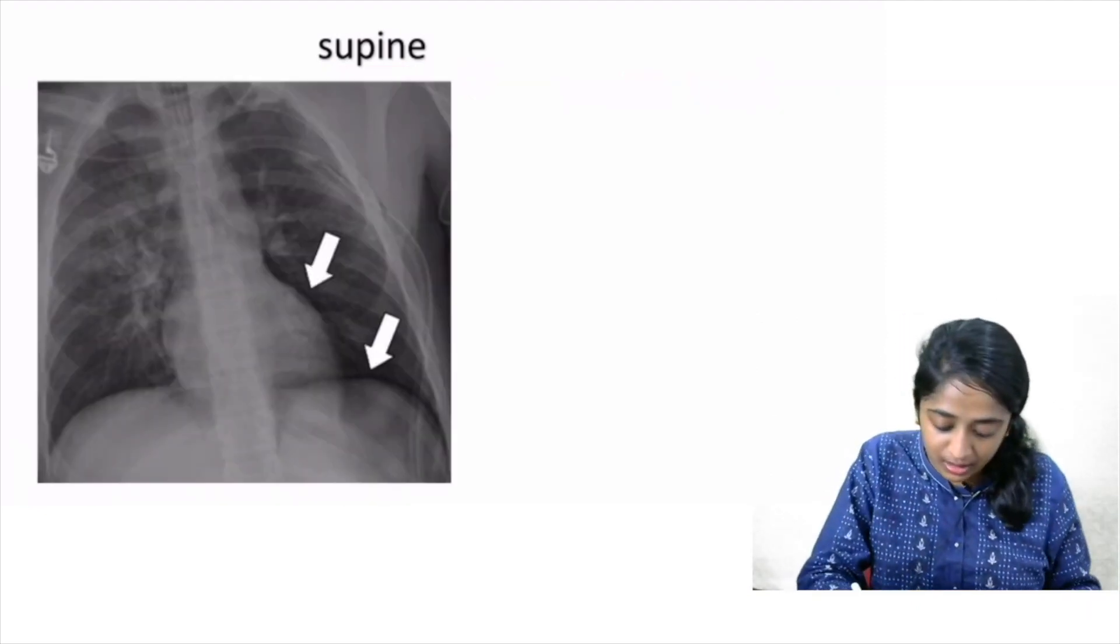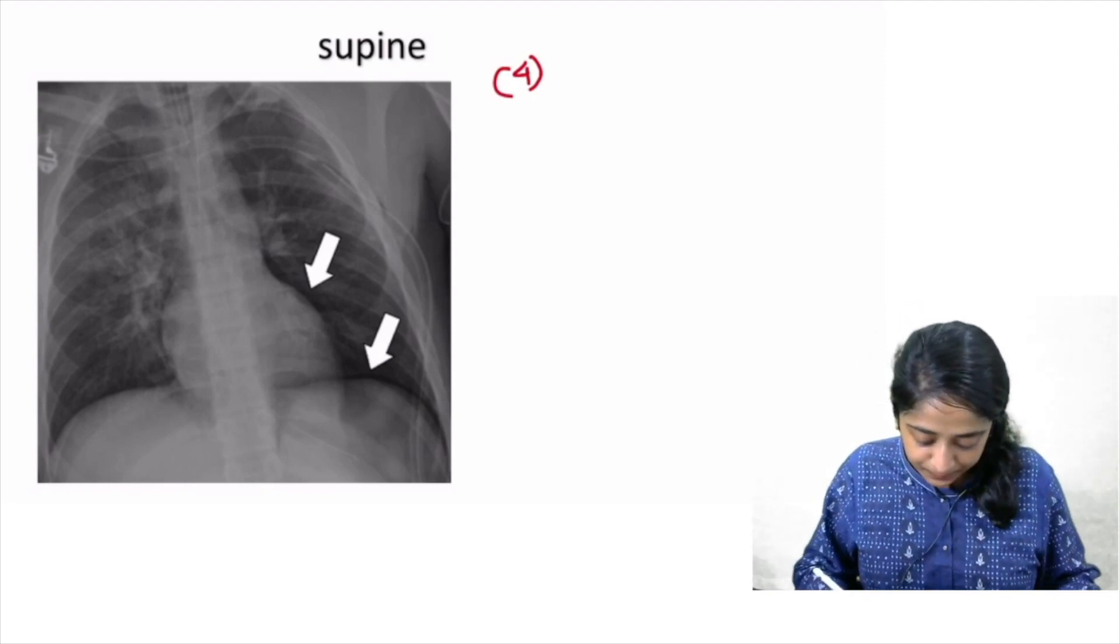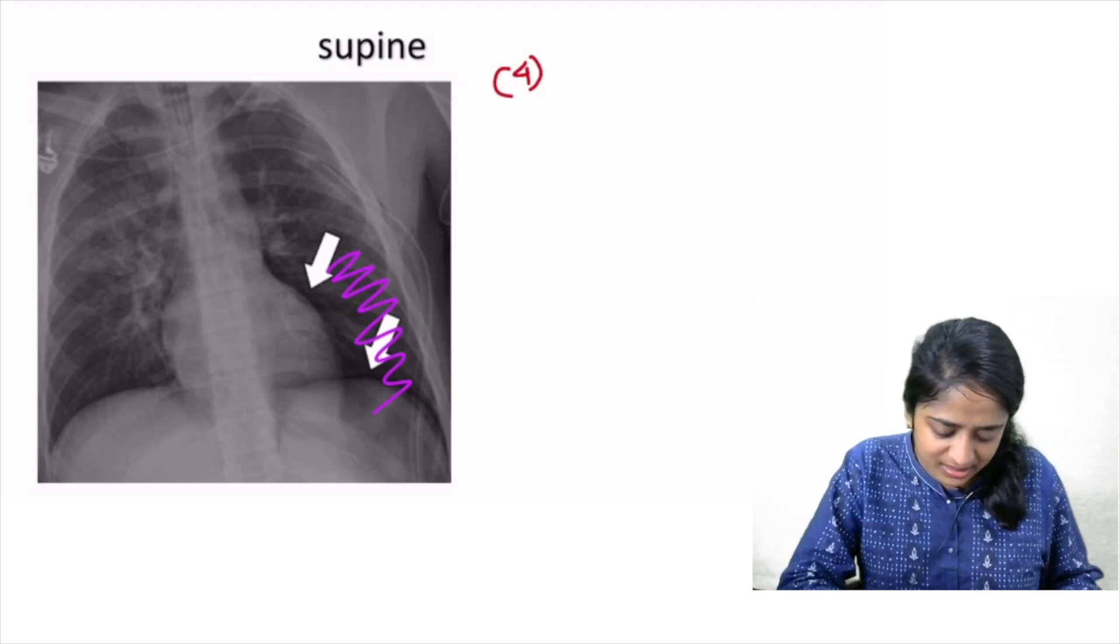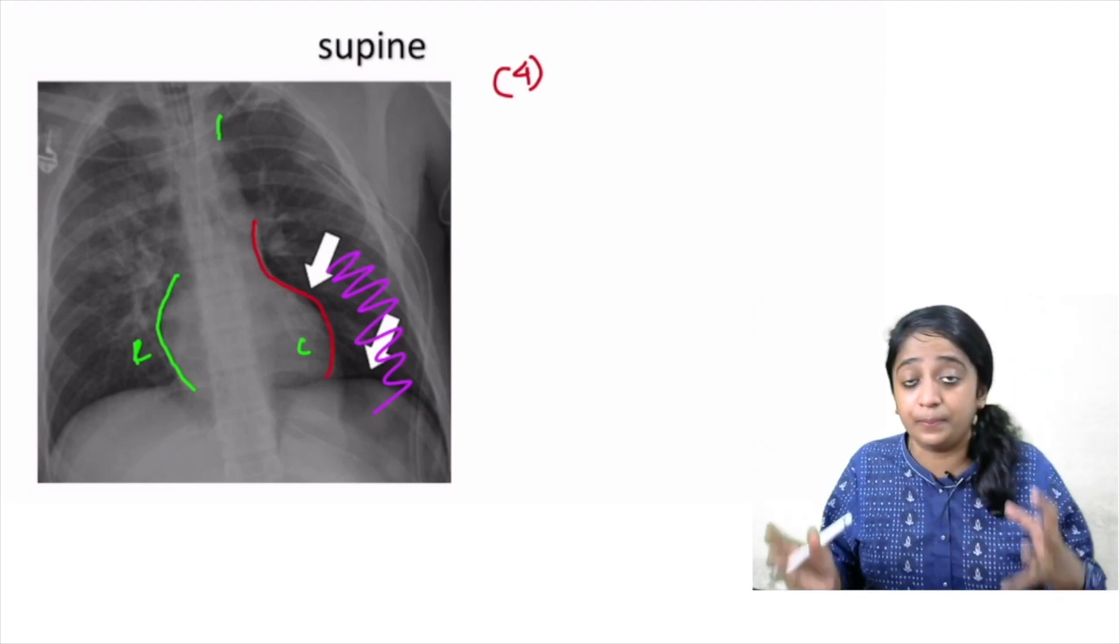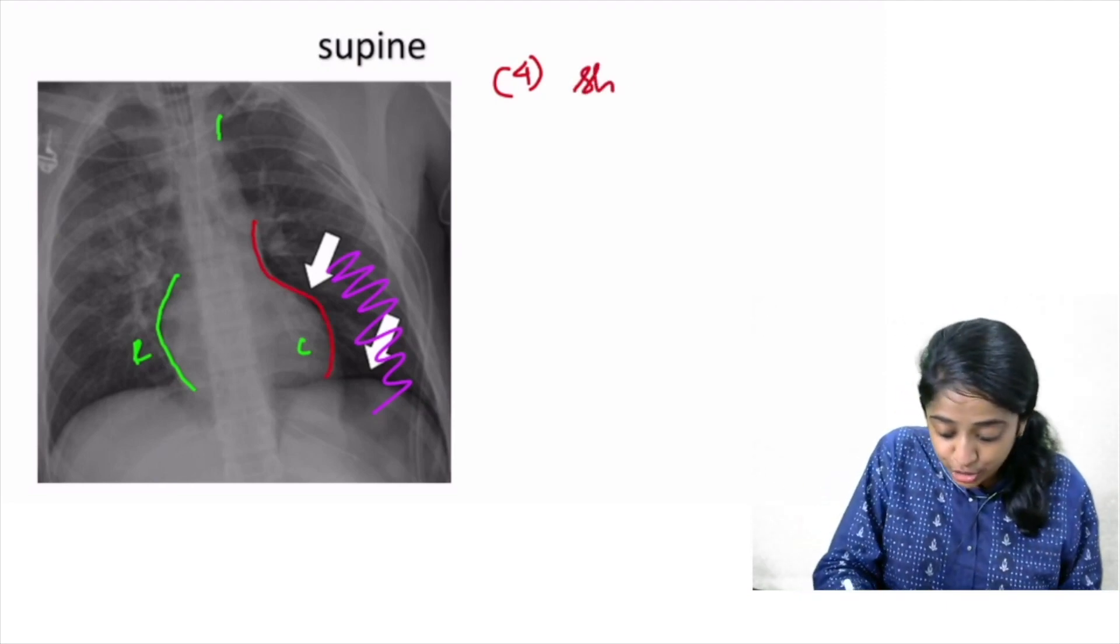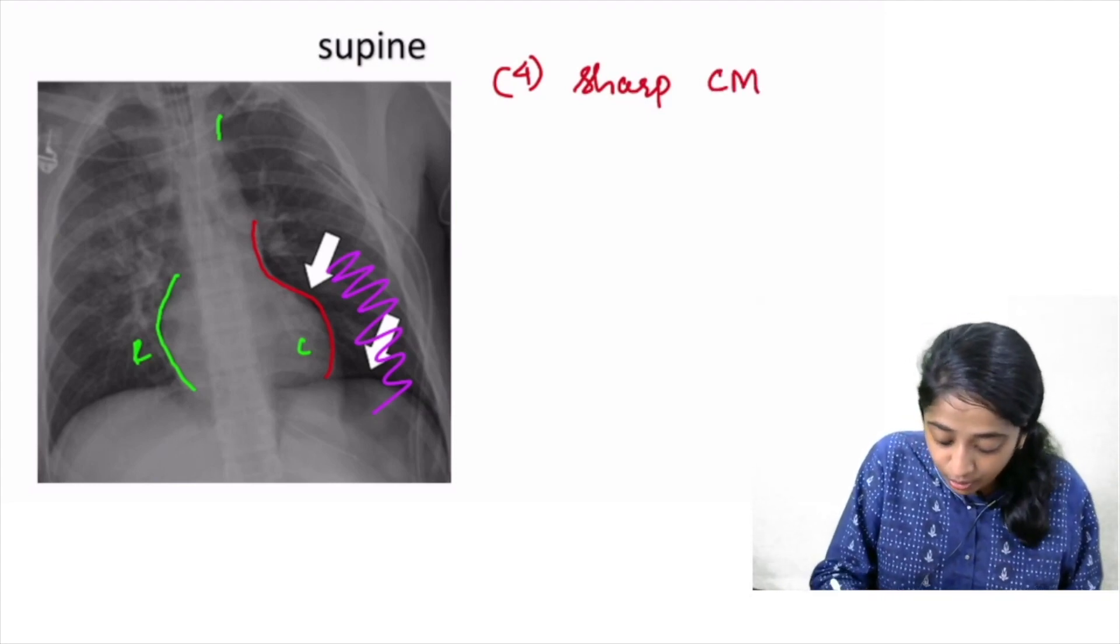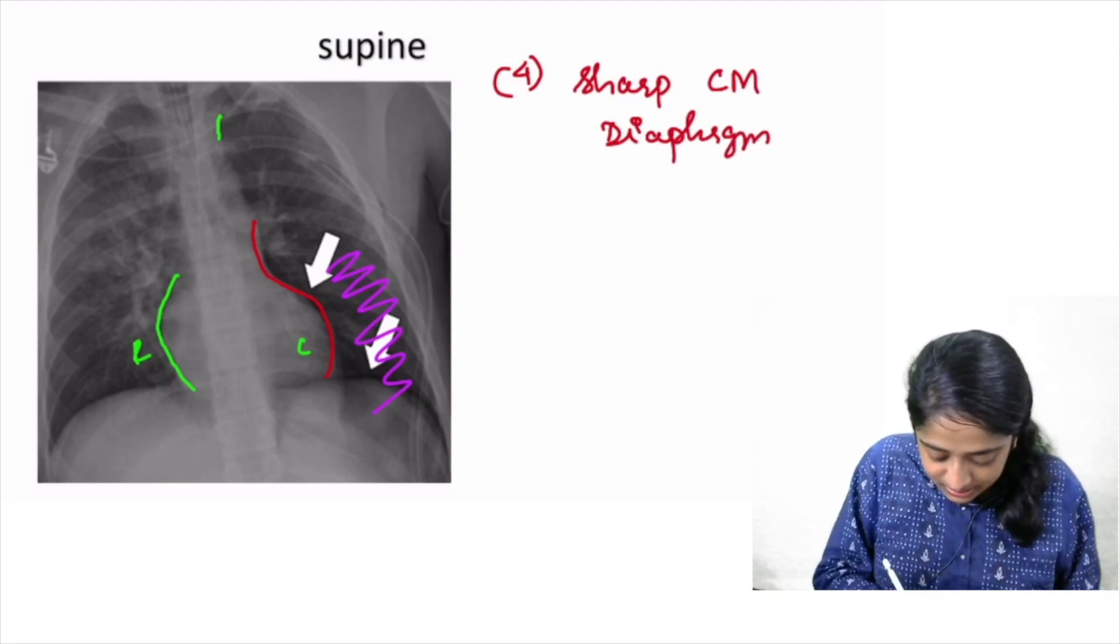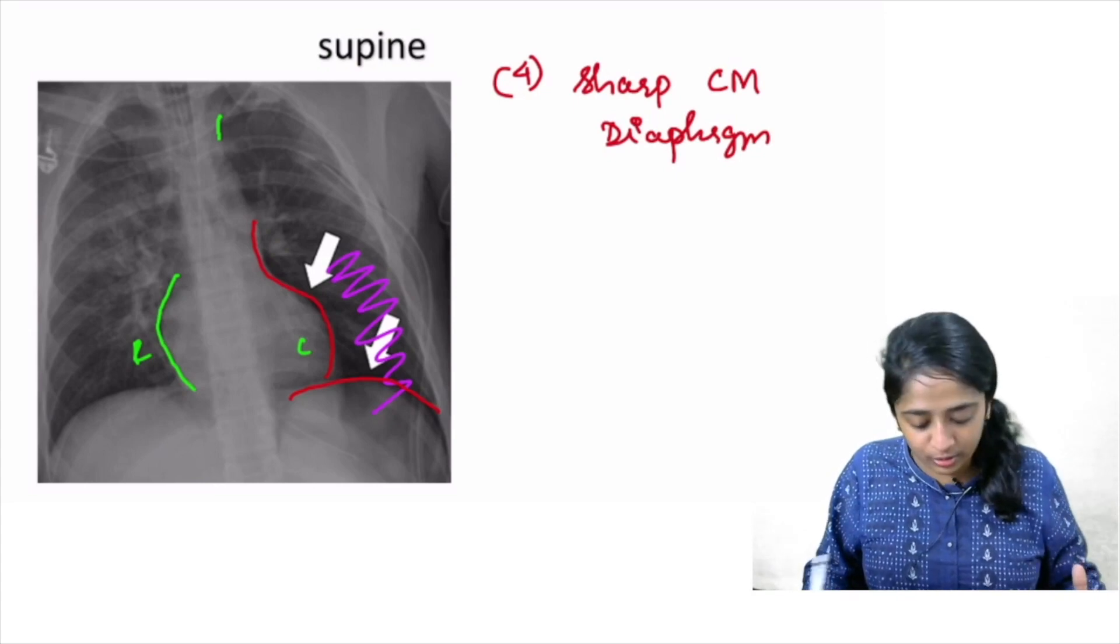Now coming to the fourth important sign that you can look for in supine radiograph. In addition to transradiancy, what else is apparent? As compared to the right side, the left side, the cardiomediastinal silhouette is appearing more sharp. So sharp contour of the cardiomediastinal silhouette or the diaphragmatic contour. Both are important signs of pneumothorax on supine radiograph. Very important.